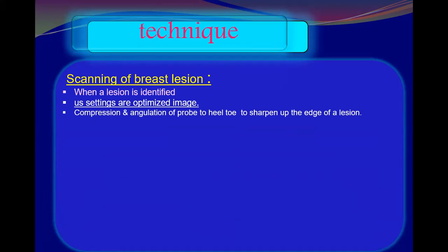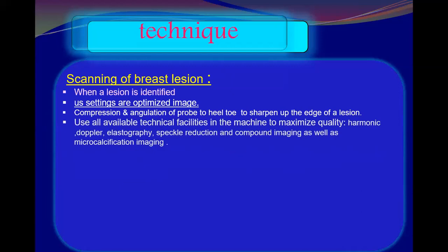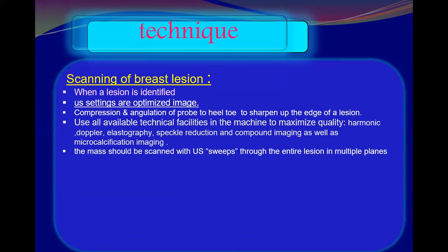Then we have to use compression and angulation of the probe to sharpen the margins, and use all facilities to maximize image quality and sweep throughout the entire lesion in multiple planes, to make sure it is a true lesion and to evaluate the lesion itself, especially its margins. And then we have to use an acoustic standoff pad when it is needed.